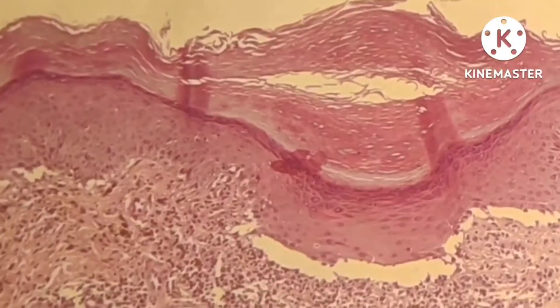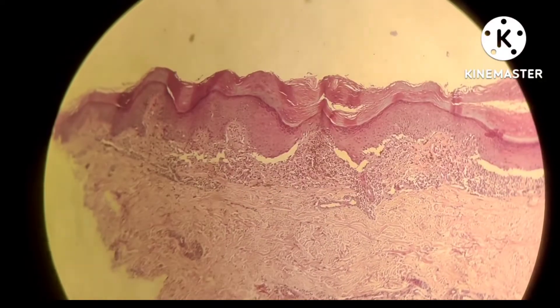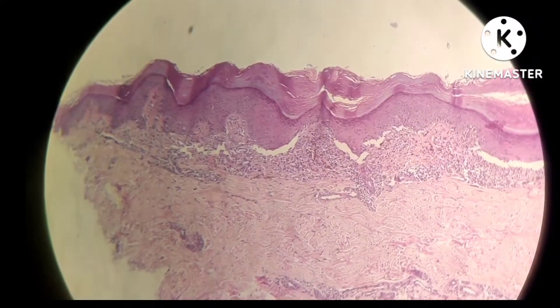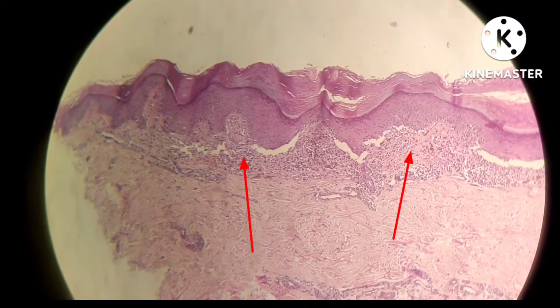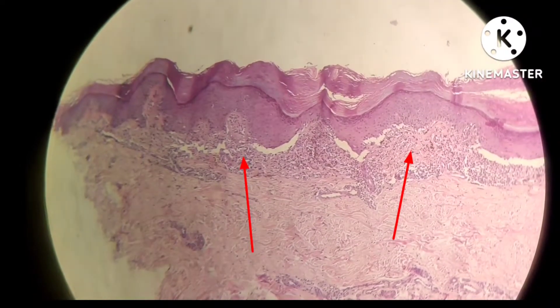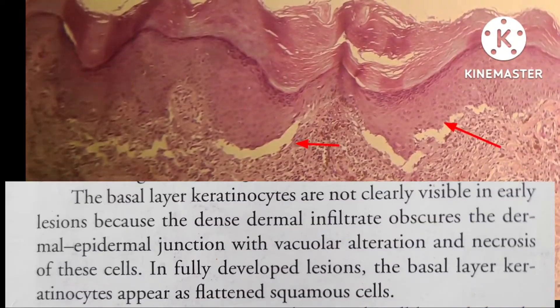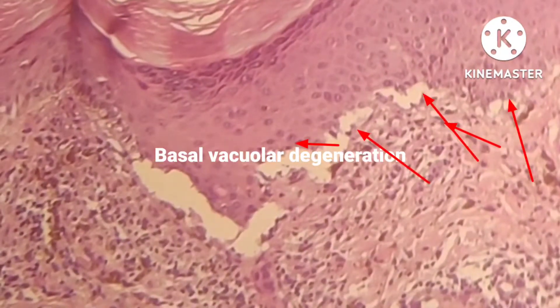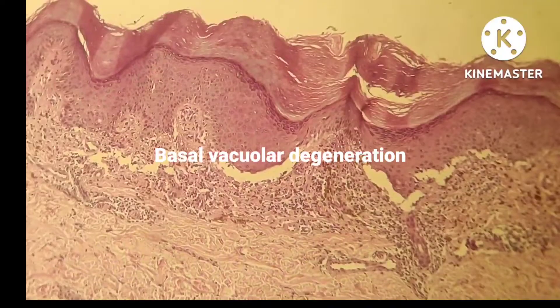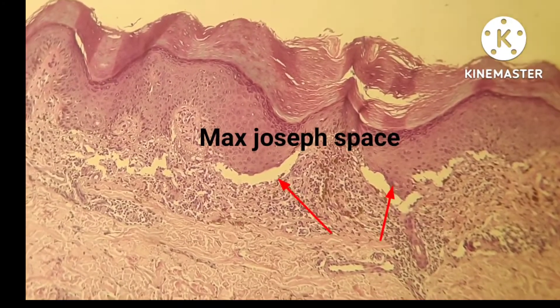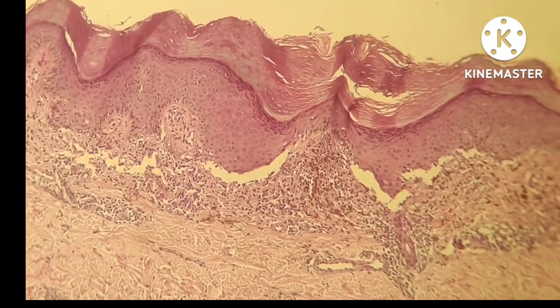There is a lichenoid infiltrate closely hugging the epidermis — a band of inflammatory infiltrate consisting of lymphocytes, macrophages and melanophages. It obscures the dermo-epidermal junction. The basal layer shows vacuolar alteration, vacuolar degeneration with presence of necrotic keratinocytes and apoptotic bodies, which are called civatte bodies.